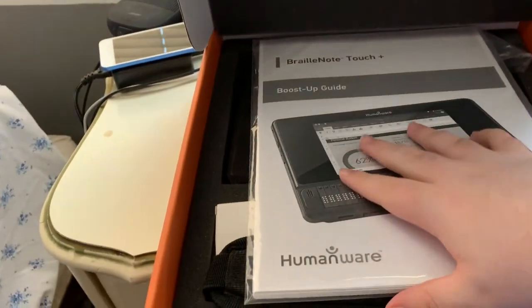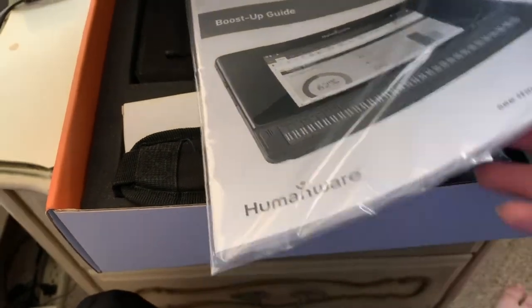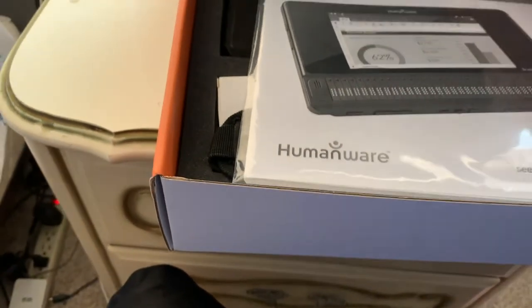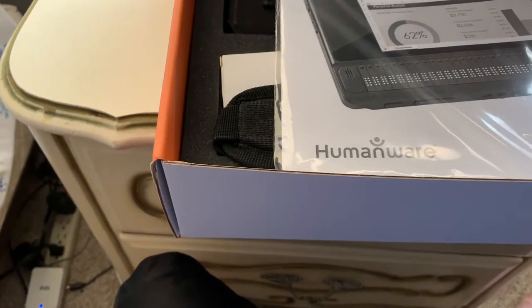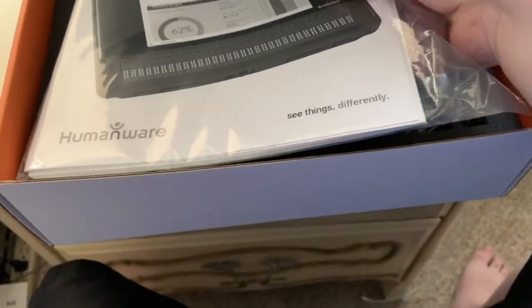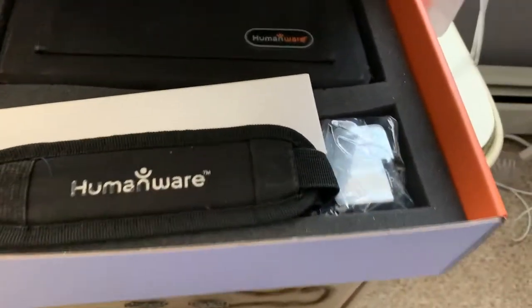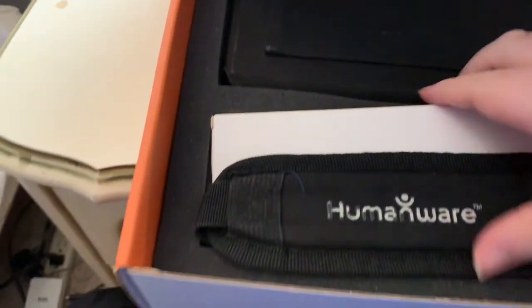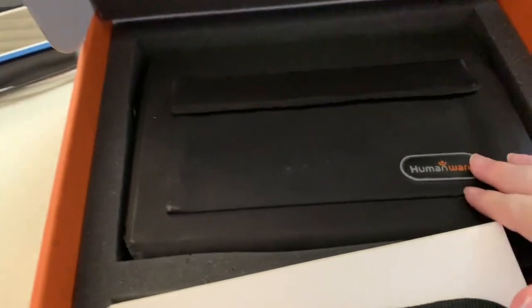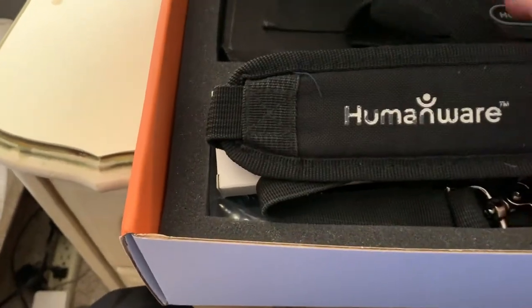At the top it looks like we get some new documentation. I'm just curious if maybe this is brailled — and indeed, I feel some braille in here. I'm going to put this off to the side. The next item I feel is the BrailleNote Touch Plus itself, and below that we have the strap.